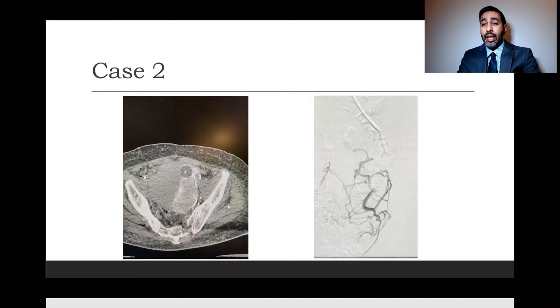Is there any extraprostatic extension? Would there be non-target embolization? You see a branch extending inferiorly. Was that going to the inferior rectal? Do a quick CT, literally bring it in. Takes about a minute or two to do that. Take an intraoperative CT, which you can see is amazing.